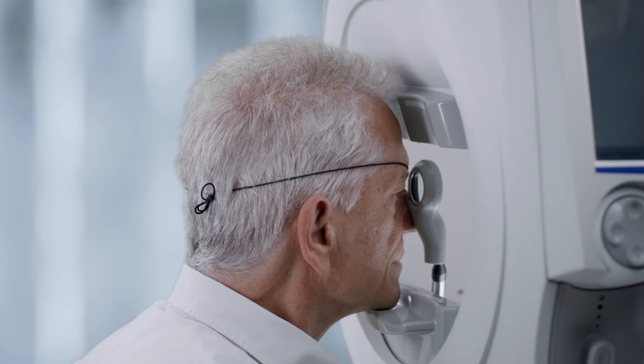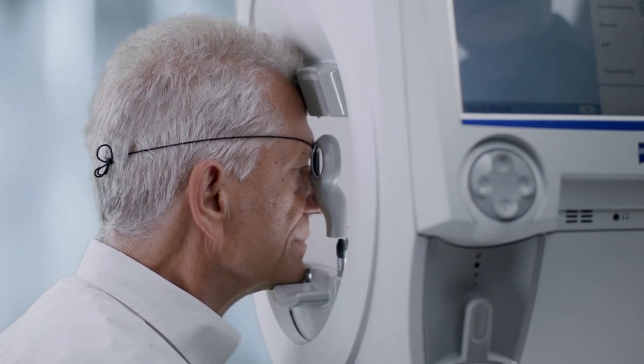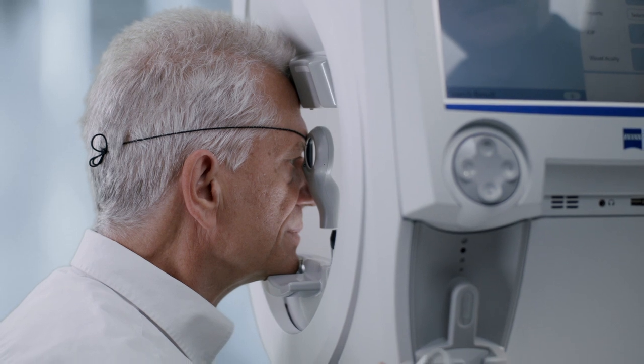Have the patient put their chin on the correct chin rest position for the eye being tested. The patient should be seated upright and comfortable. Use the table adjustment first, then the chin rest adjustment, to position the patient to the approximately correct eye position in relation to the trial lens.